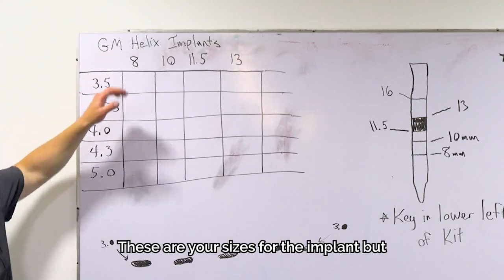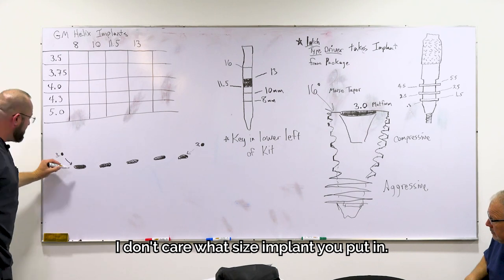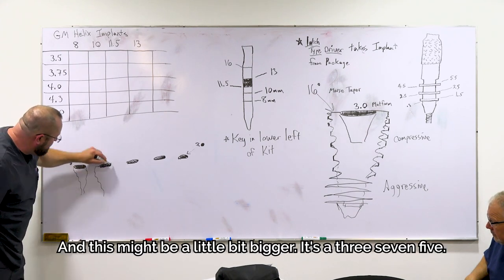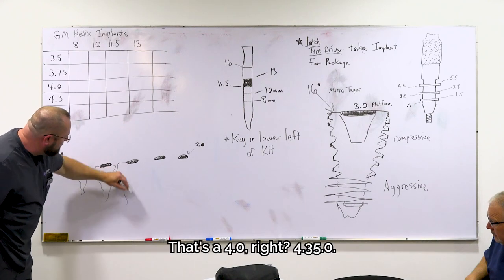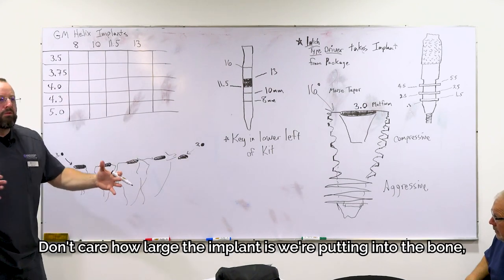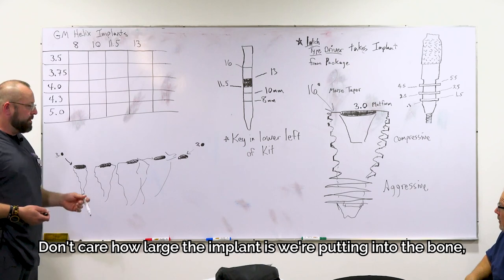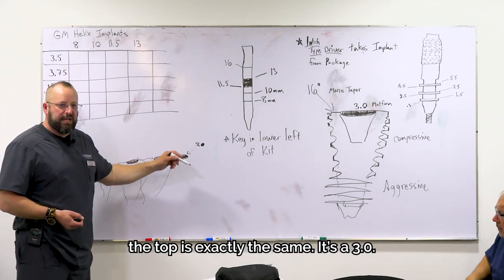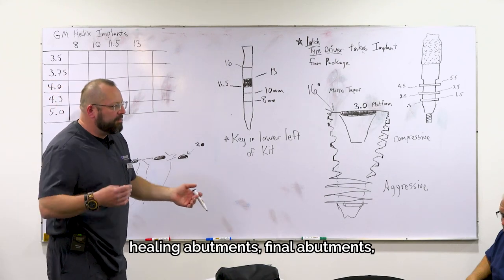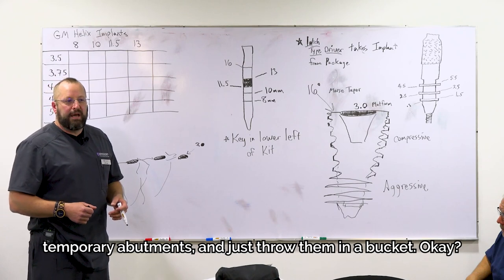Last thing, I'm just going to remind everybody this is fun. These are your sizes for the implant, but I don't care what size implant you put in. This can be a 3.5, right? And this might be a little bit bigger. It's a 3.75. That's a 4.0, right? 4.3, 5.0. Don't care how large the implant is we're putting into the bone. The top is exactly the same. It's a 3.0.